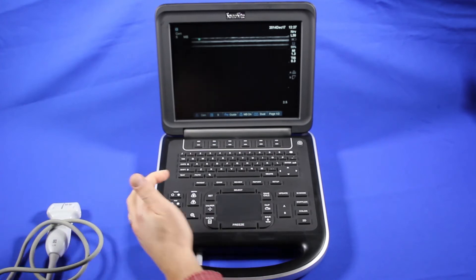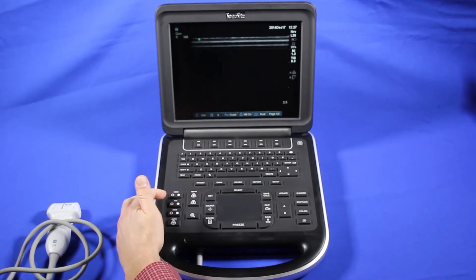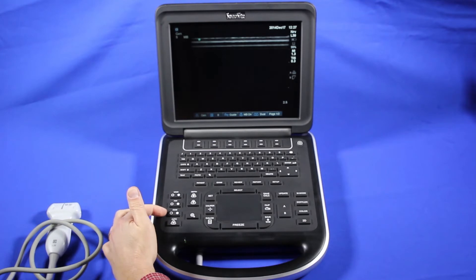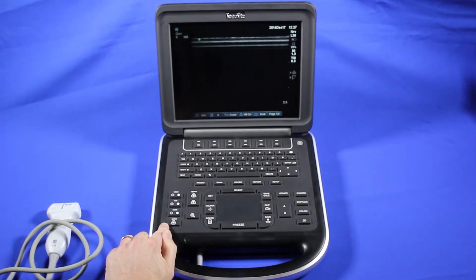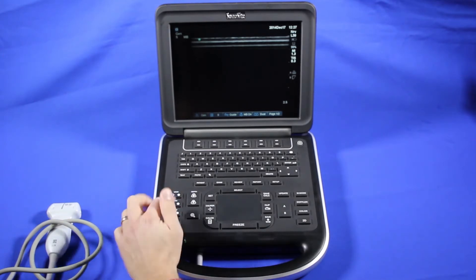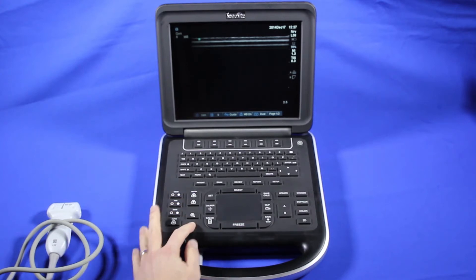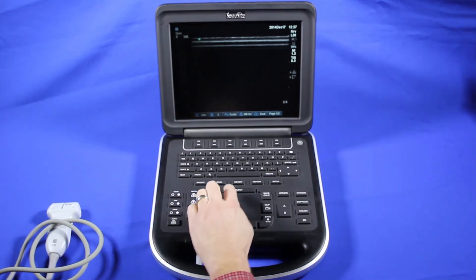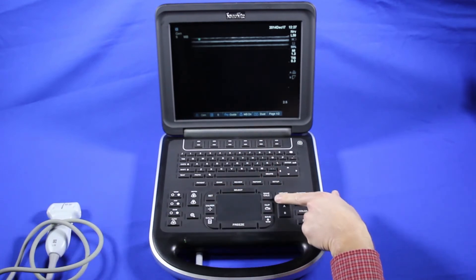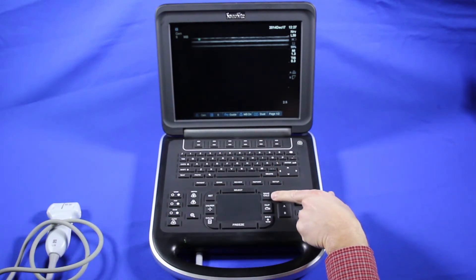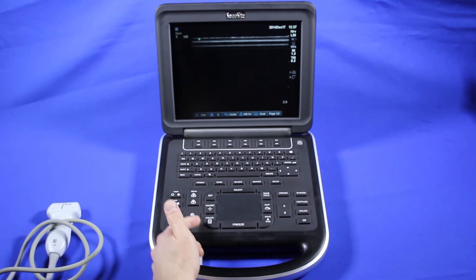On the left-hand side, we have our gain controls. We have near field, far field, the regular gain — which is for the full gain — and auto optimization. We have our depth keys here, zoom, set for setting our calipers, select for selecting certain things on the screen. Save calculations after you make your calculations, which is over here.